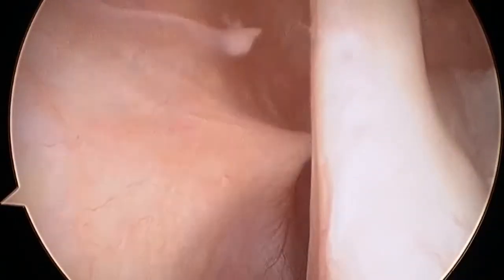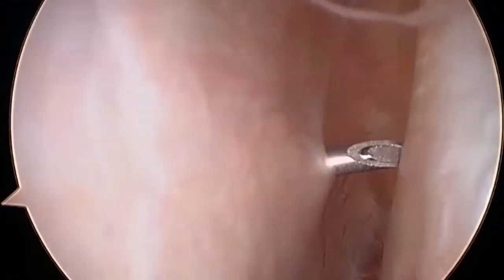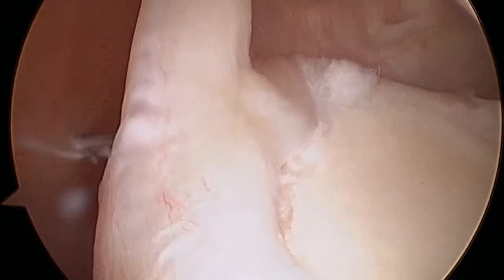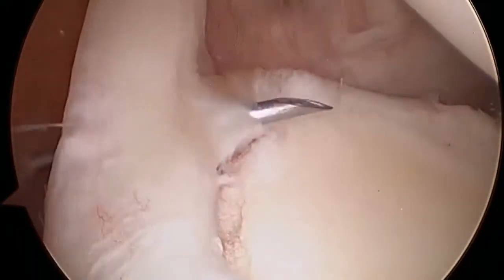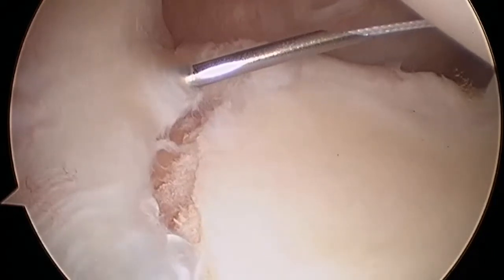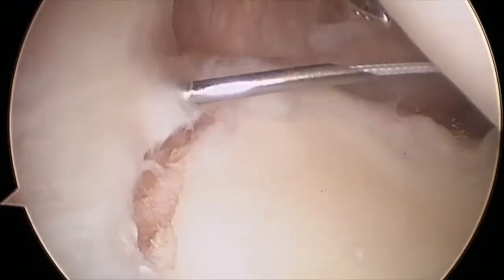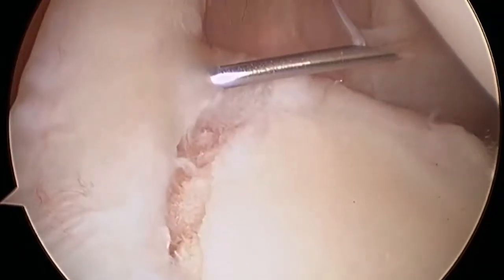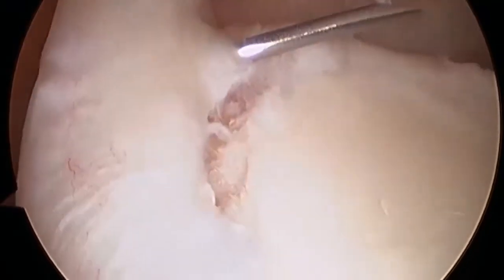An 18-gauge spinal needle is introduced via the Neviasa portal to pass through the base of the long-headed biceps and run approximately parallel to the glenoid face. A fibre stick suture is introduced via the needle and delivered into the joint. The suture is then grasped and retrieved via the anterior portal.